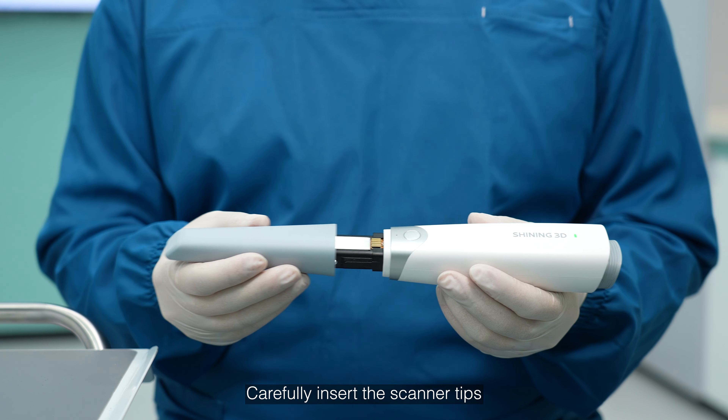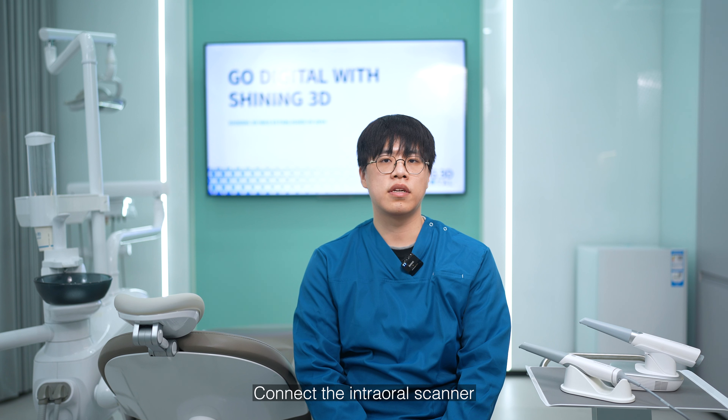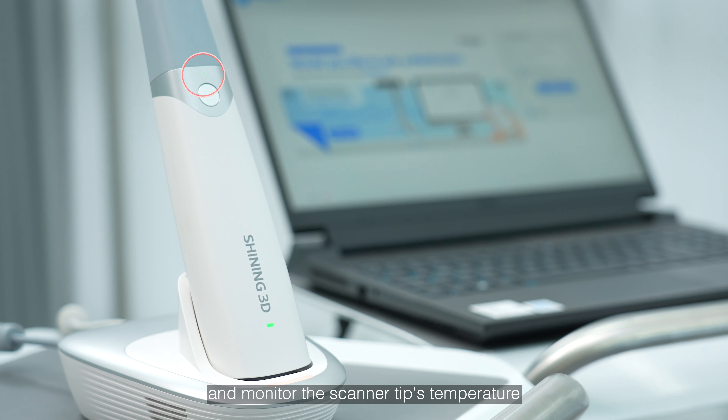Carefully insert the scanner tips into the device body with their lens facing downward. Connect the intraoral scanner to the computer and power it on. The heating mechanism will actively and automatically monitor the scanner tips temperature once the indicator light on the device body illuminates.